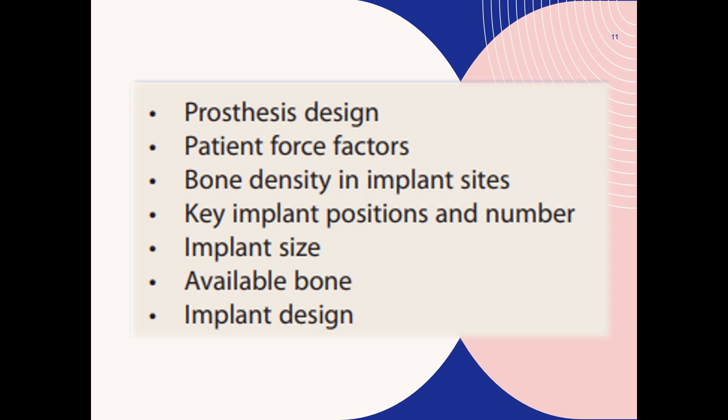The implant size, again we have discussed it in our implant biomechanics session. The wider root form implants have got a greater area of bone contact than narrow implants, resulting from their increased circumferential bone contact area. So the increase in diameter not only decreases stress but also decreases the likelihood of implant fracture and also reduces forces to the abutment screw. But we cannot use implants that are wider than 5 mm, which is due to the stress shielding effect. We have already discussed it in our implant biomechanics session.